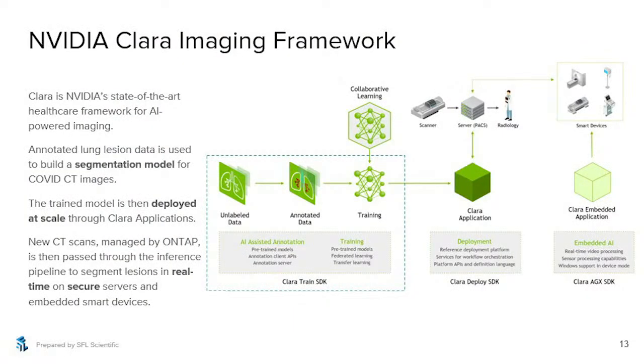You can check out my technical report, NetApp ONTAP AI Reference Architecture for Healthcare Diagnostic Imaging, on netapp.com for more information on how we use Clara AI server with MITK to perform hippocampus segmentation. It was my first project at NetApp. I loaded brain MRI slices with pre-trained models, annotated extra images for transfer learning, and fine-tuned the model on the DGX system. During these extraordinary times, Clara has released a fully pre-trained lung lesion segmentation model, which is perfect for our use case, as Igor just covered.